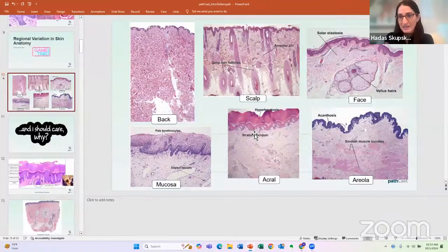So you'll learn with Dr. Junkins Hopkins about the interface inflammatory reaction patterns in our upcoming series. But in all of those, a characteristic finding of interface is some dyskeratotic dead red keratinocytes, sometimes just at the junction and sometimes scattered higher up. And you're not wrong if you call them Civatte bodies. It's just that that particular term is characteristically used for lichen planus. So when they're in other entities, I sometimes will call them just dyskeratotic keratinocytes. Sometimes I call them cytoid bodies. So you're not wrong. It's really the same thing.